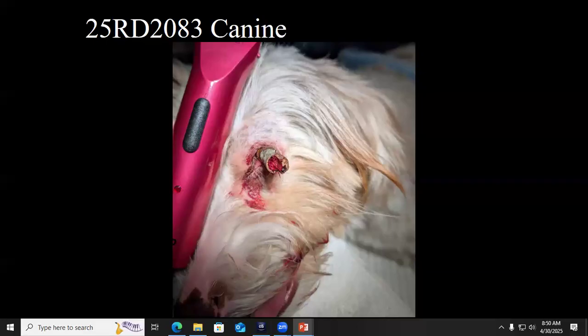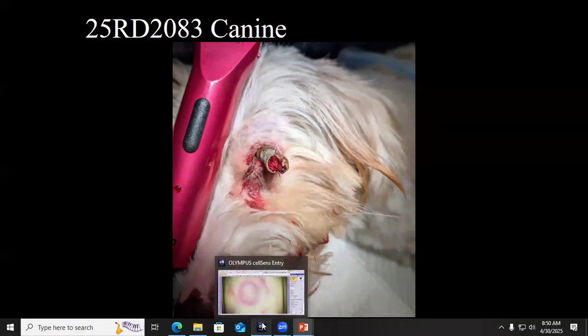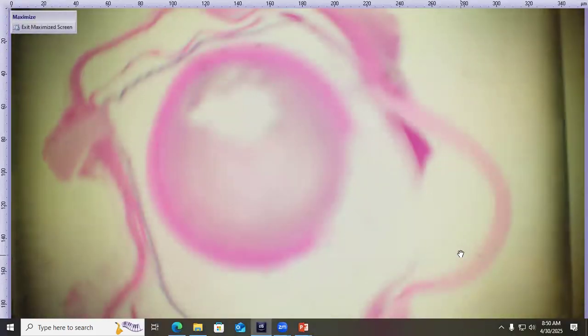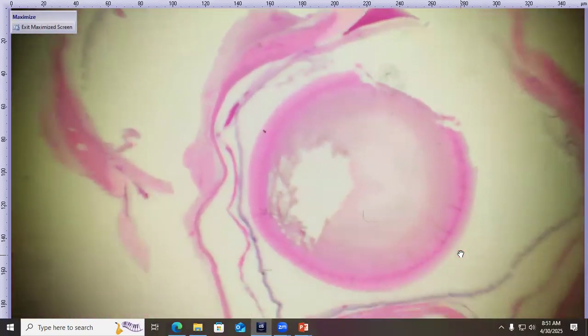Yes, so I was all prepared. The clinician had emailed this photo to us ahead of time and said, "Hey, be on the lookout. I'm sending you this case." Mostly just out of fun. And so I was all excited to take this awesome gross picture for you guys of a stick in the eye. However, when we got the globe, it was not super impressive.